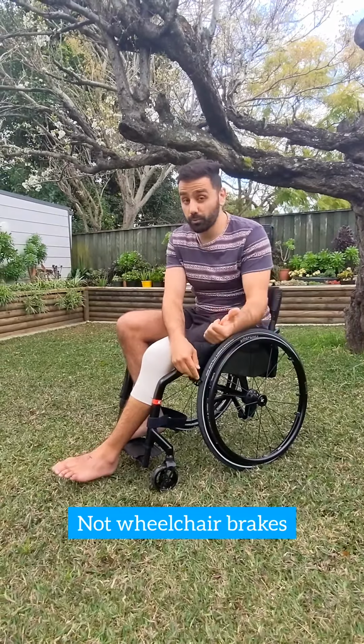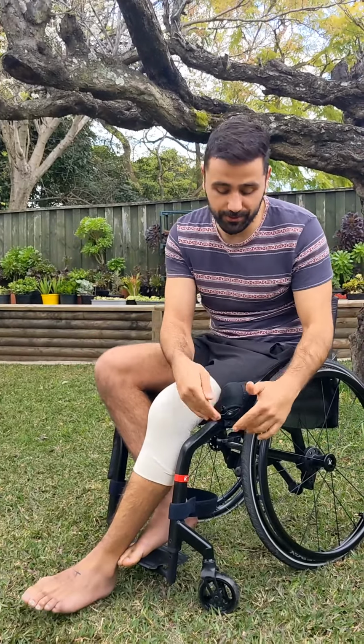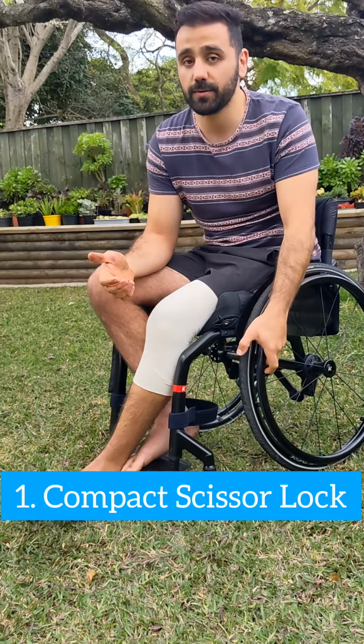Now, first of all, I call them wheelchair locks for a very important reason. There are wheelchair brakes and there are wheelchair locks. Today we're just going to be talking about wheelchair locks. So the first wheelchair lock we're going to talk about are the ones on this chair over here. But they're essentially most commonly known as compact scissor locks.